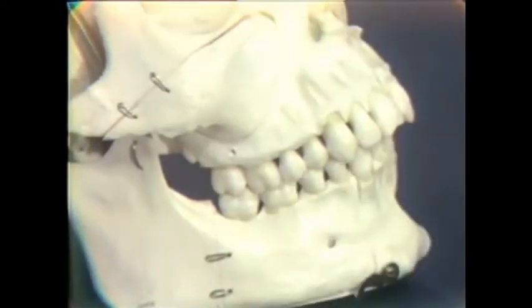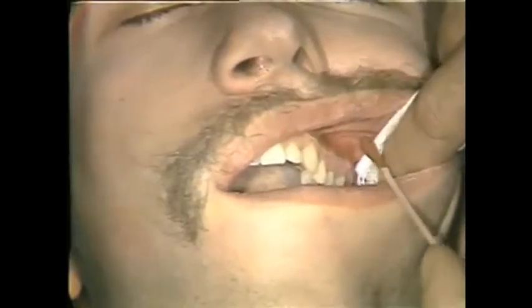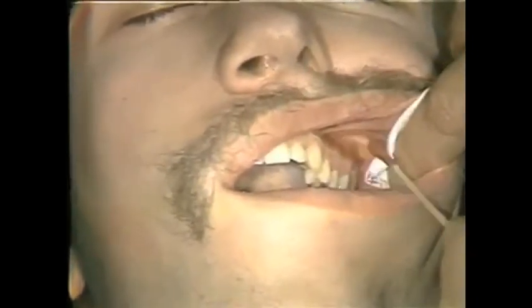All right, let's demonstrate it on the patient. And if you'll open about halfway for me, please. And we might close just a little bit. That's perfect, Andy. I'm drying the mucosa here now. And then we'll apply our tincture of betadine directly above the first molar.